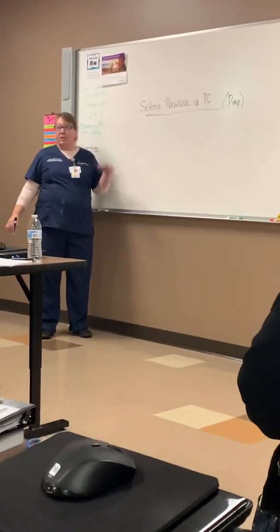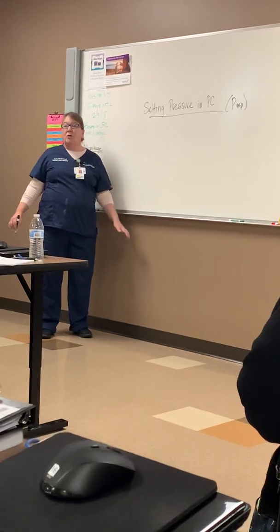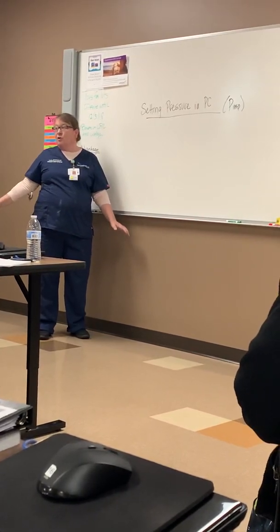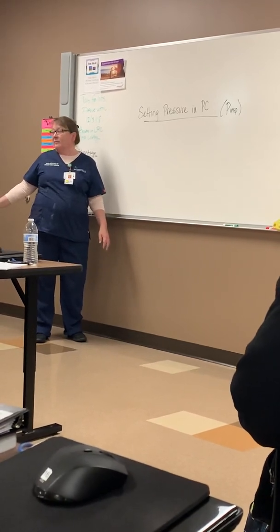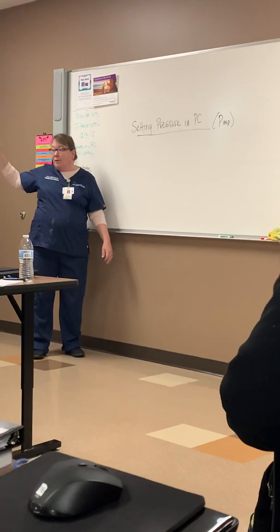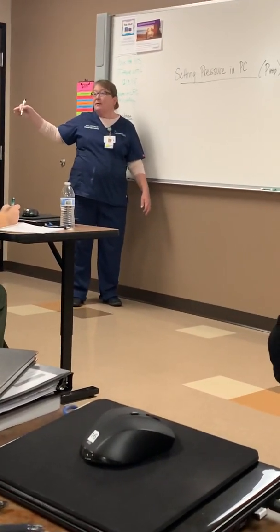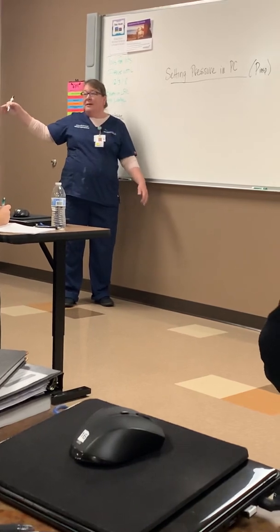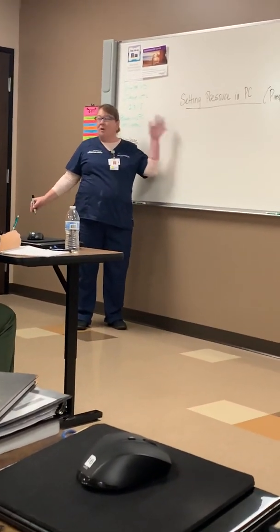And it's not pressure support. Pressure control and pressure support are two different things. Support is supporting a spontaneous breath. Keep the S's together. Support is, and it's only in SIMV. So see, we got all the S's. Pressure support for a spontaneous breath in SIMV. Pressure control is a mode.